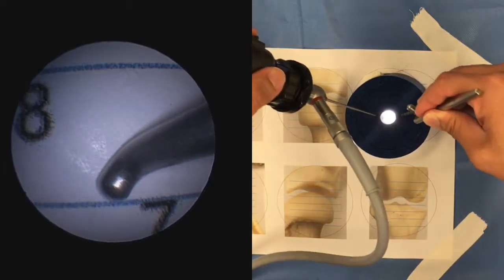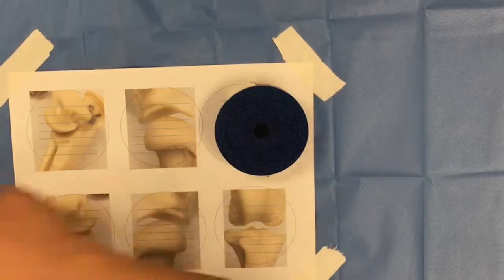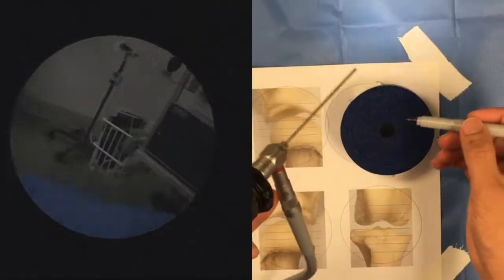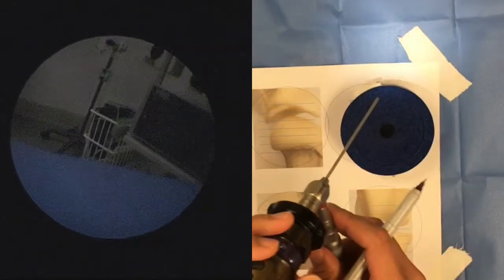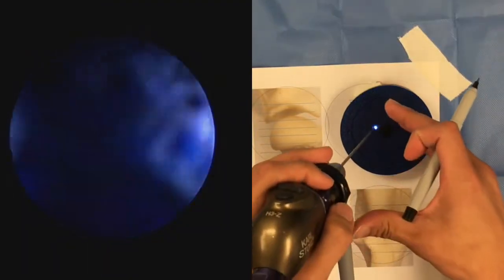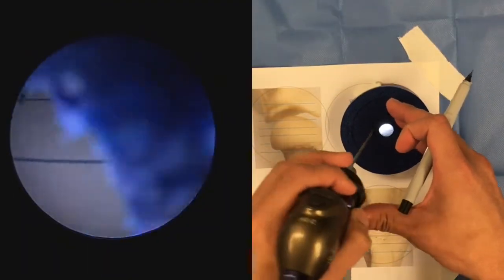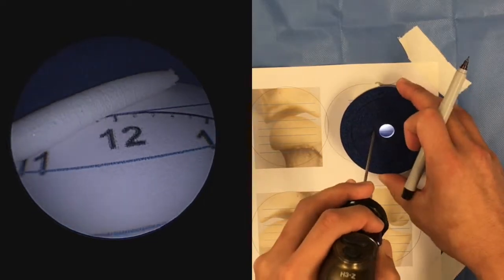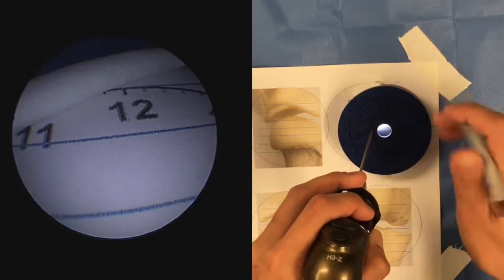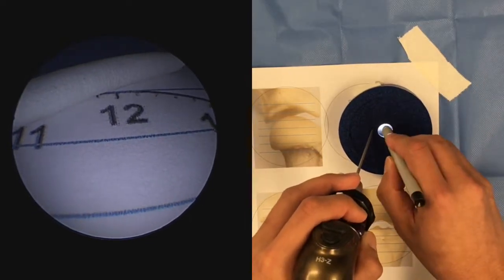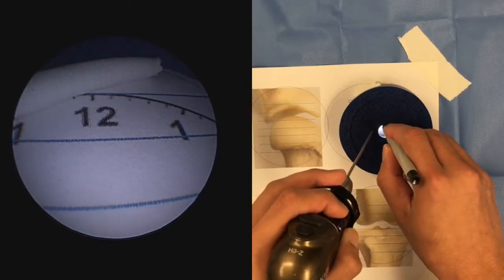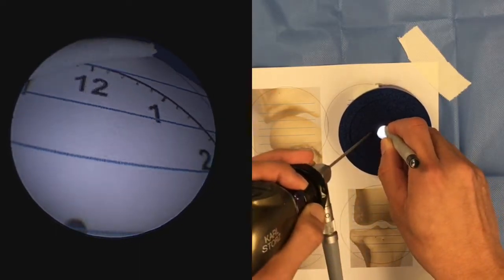To continue to help develop triangulation skills, we're now going to attempt to draw a star. We're going to connect some of these numbers to draw a five-pointed star with a sharpie marker that's going to be introduced through the larger hole in the center. Do this with both left and right hands.